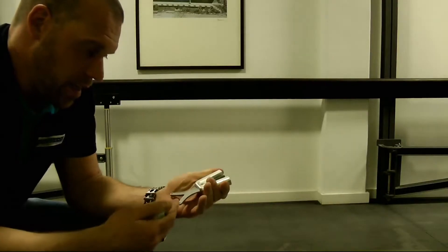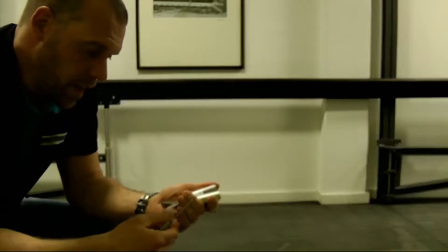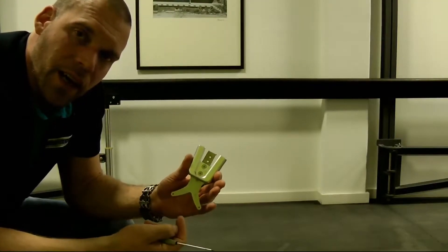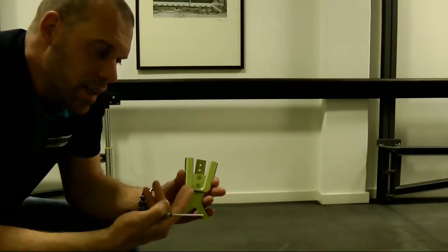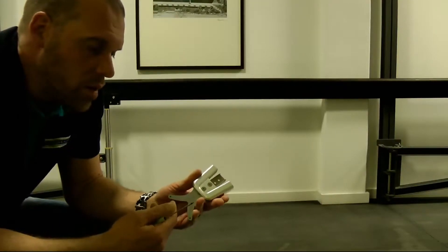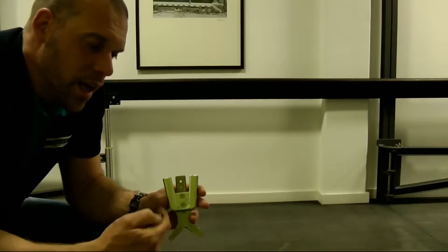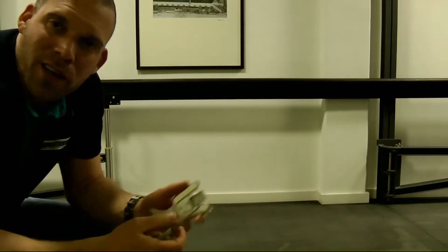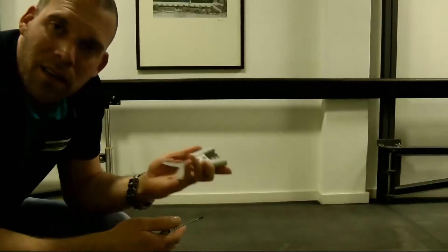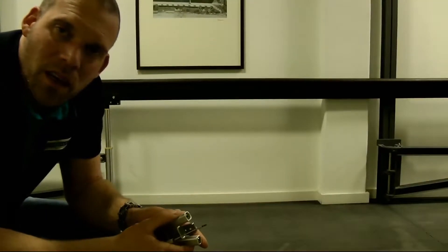In the following steps, we would like to select the correct spring unit. To be more precise, we want to determine the correct spring force — that is the required spring strength. It makes sense to do this without the limitation of the static stops in order to find out the complete advantage of the neuroswing joint system.